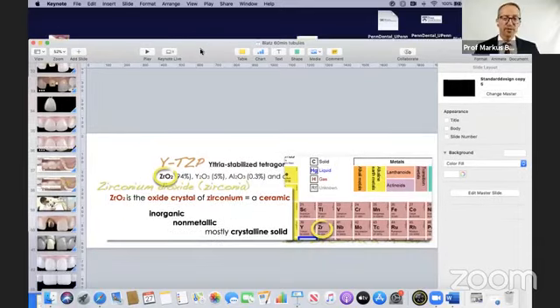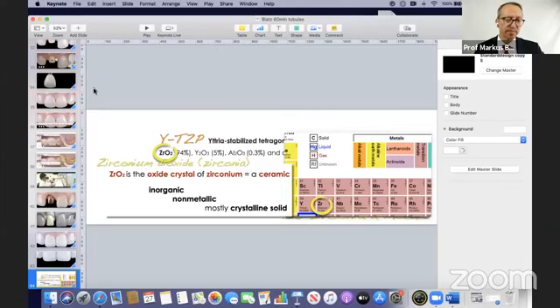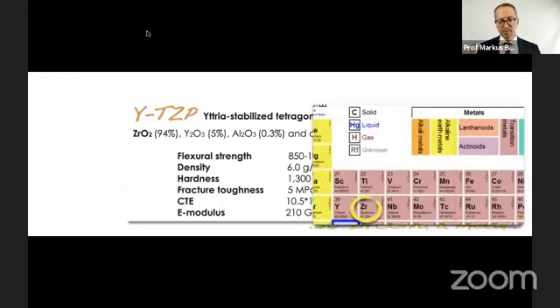So there's a few things about zirconia. We talk a lot about it, but I also want to clarify for everyone who listens that there are some misconceptions out there. One of the misconceptions is I hear people say zirconia is a metal. Please understand, zirconia is not a metal. If we think it's a metal, we may make mistakes, because then we use it in circumstances where we shouldn't use it. And then people say, but zirconium is a metal, and it's true.